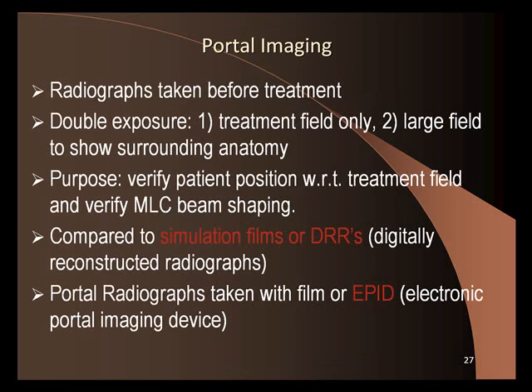Oh, shoot, some of these are out of order. The portal imaging should have been back when we were talking about portals. But this is just a repetition of what I said before. Radiographs are taken before treatment. So these portal radiographs are taken on the first day, after the treatment plan is done, when the patient comes for treatment. And the double exposure is, on that slide we were looking at, we had a double exposure portal radiograph.